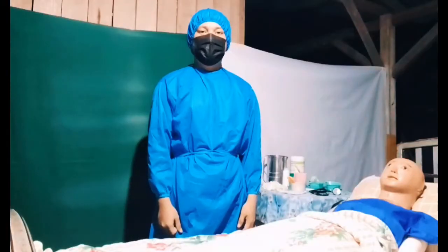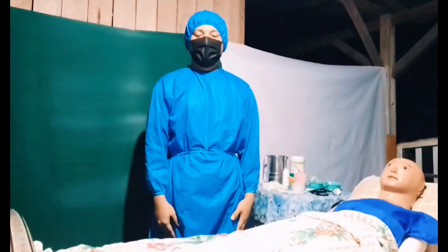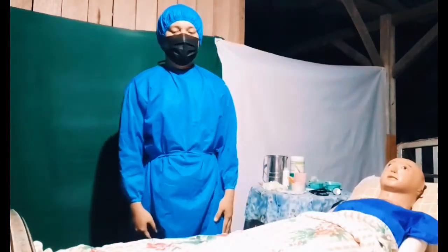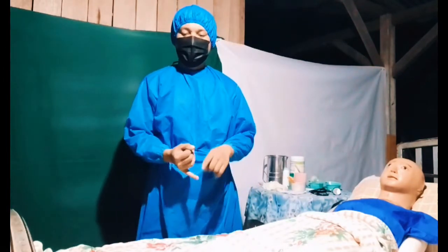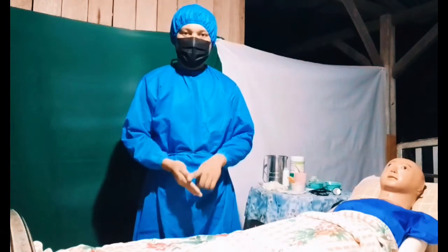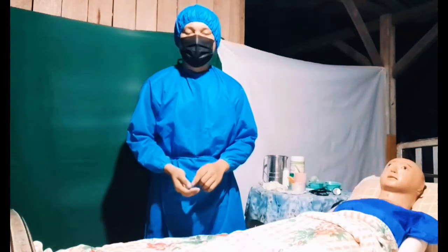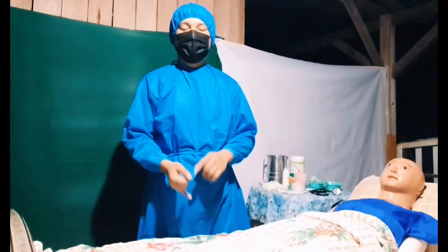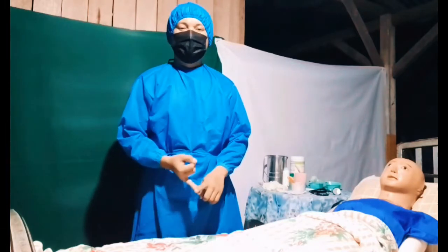I am NGT. Today I'm going to demonstrate nasogastric therapy. Before that, you must know the patient's data: the name, birthday, address, status, and vital signs. And also, you must read the doctor's order, the patient's condition, and the doctor's diagnosis to the patient.